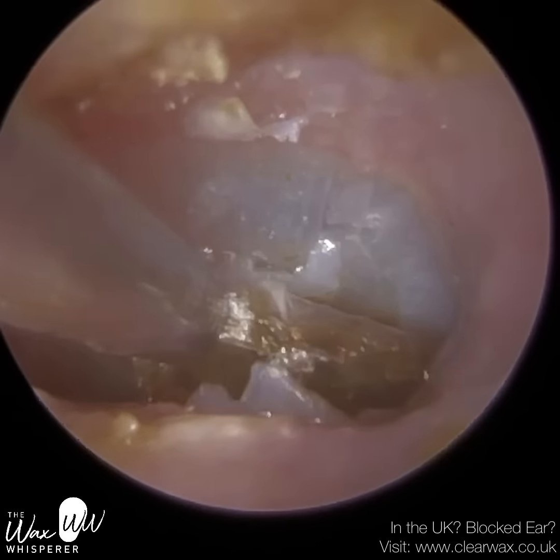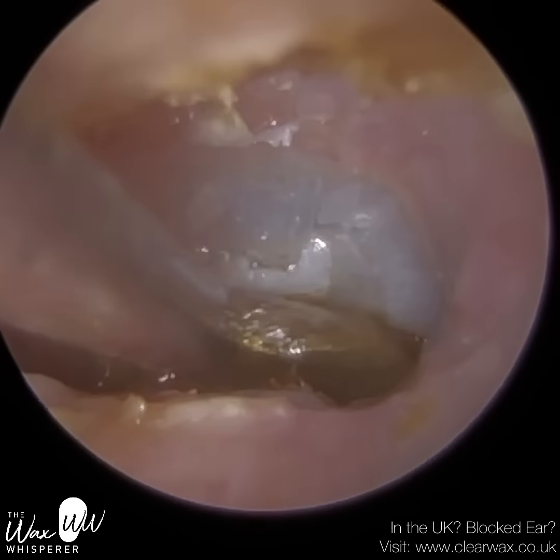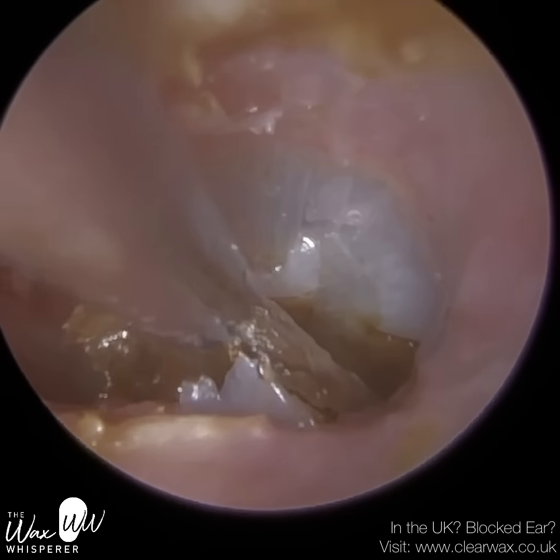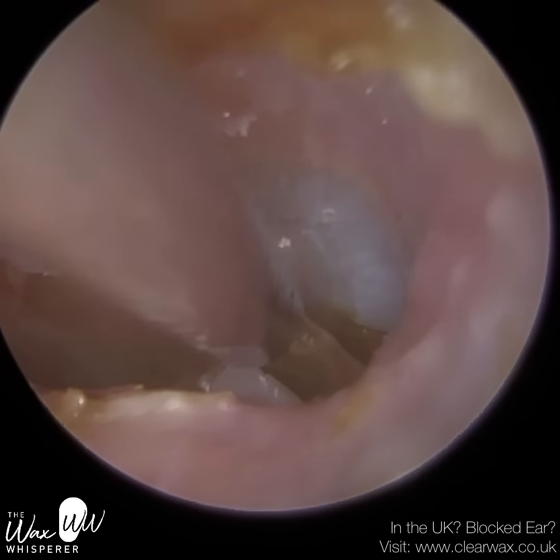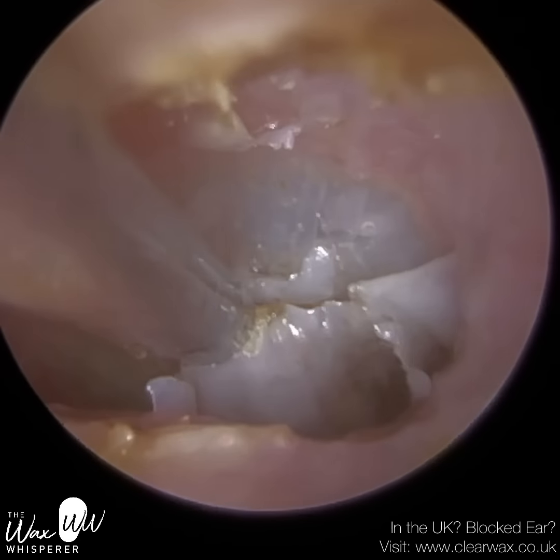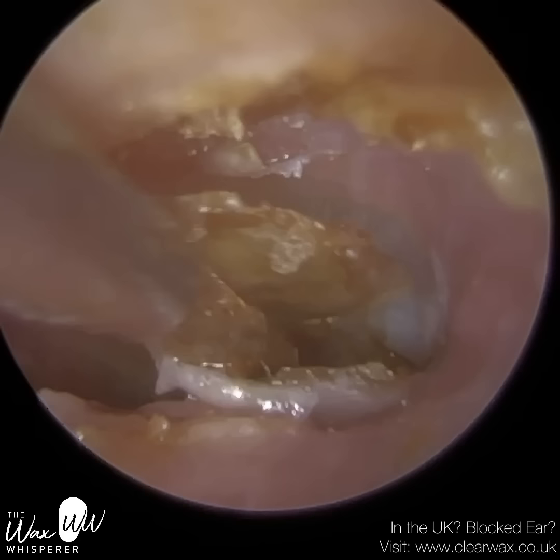And it's just attached itself to the bottom part of the eardrum, the inferior recess. I'm just going to dislodge it. I'm trying to just wriggle it. So what's happened here, as the skin is dying and shedding off the eardrum, it's almost folding back upon itself and then reattaching itself to the eardrum. You can see that it's a lot bigger piece of skin than I initially believed it would be.